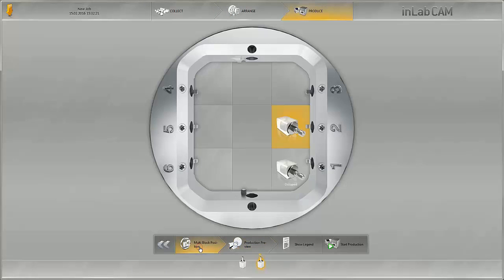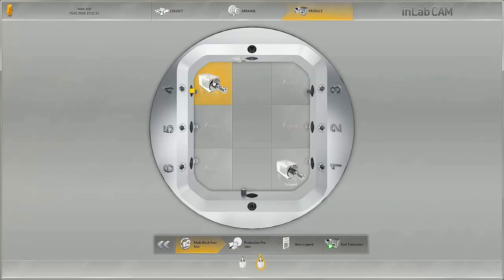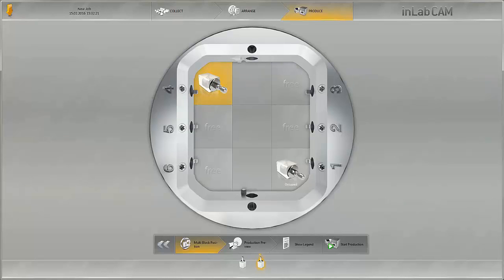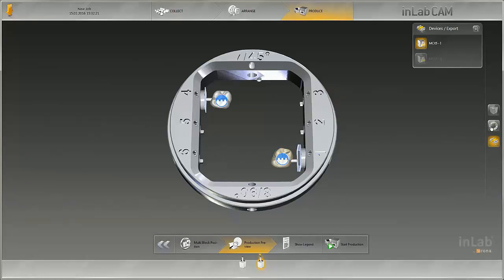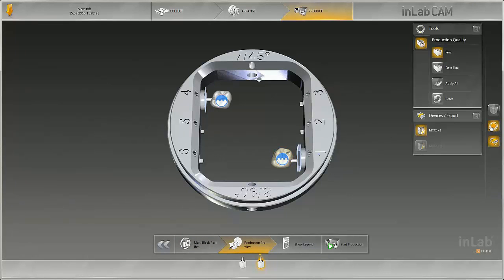The block positions can be changed subsequently. Here too, the production quality of the restorations can be defined.